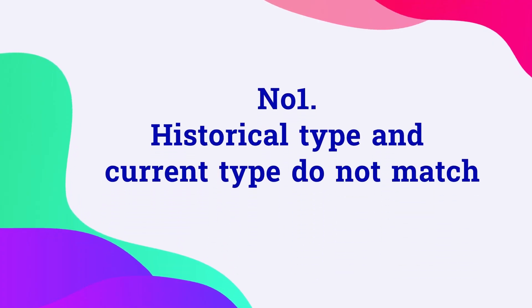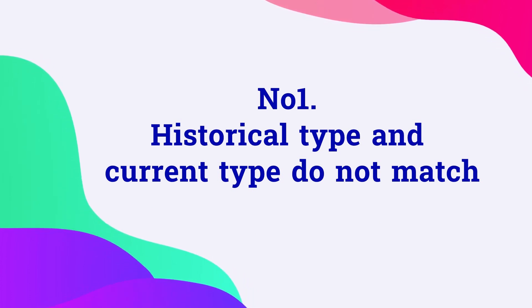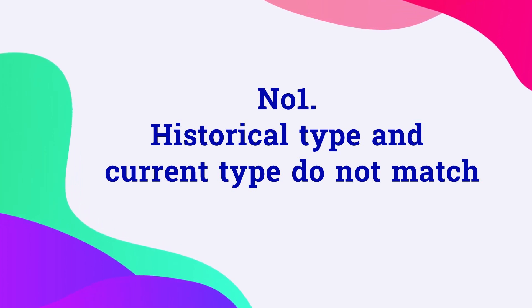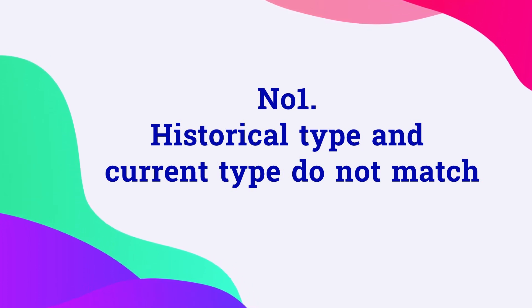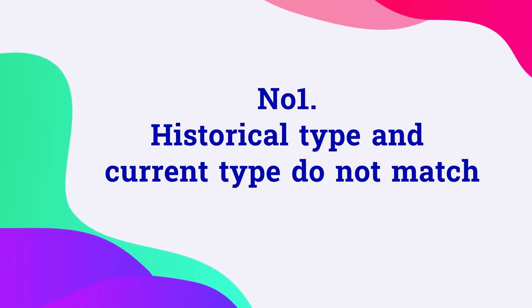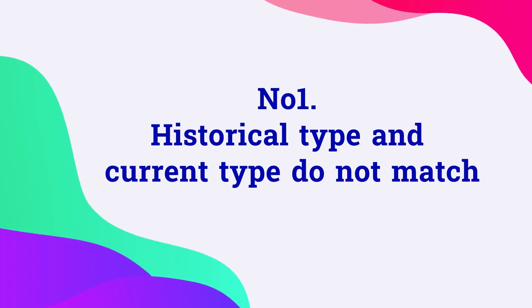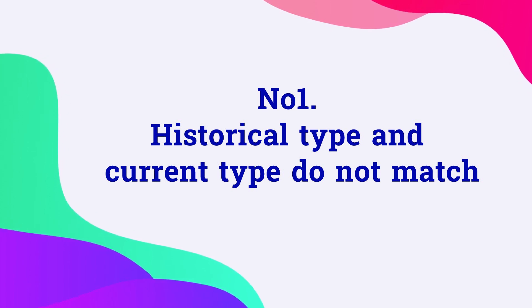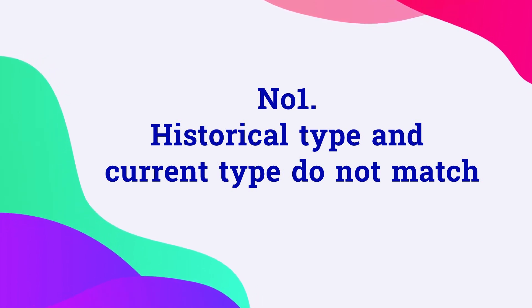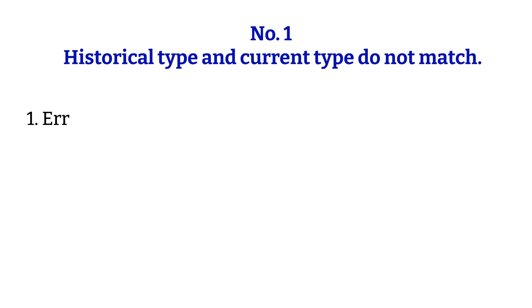Number one: historical type and current type do not match. It's common knowledge that our blood types do not just change out of the blue — they don't change without a reason. But there are a few conditions that could change our blood types. Take a few minutes to write down those conditions, and what do you do when the current specimen blood type and historical blood type do not match? I'll give you a few moments to list the possibilities. You can pause the video. Time's up! Let's see if your answer matches what I have.